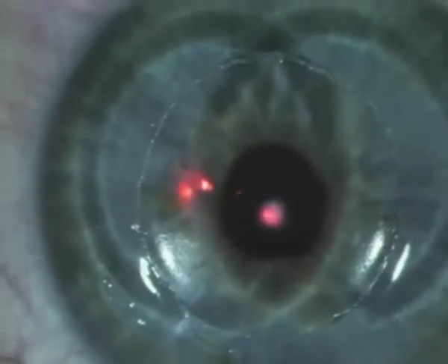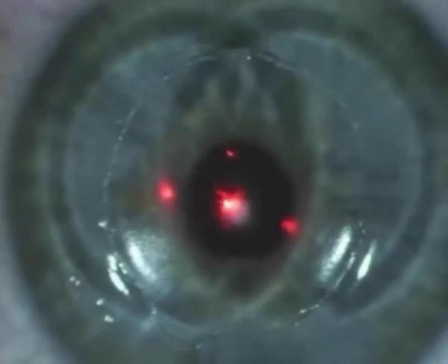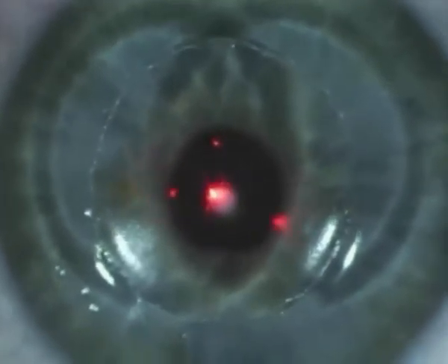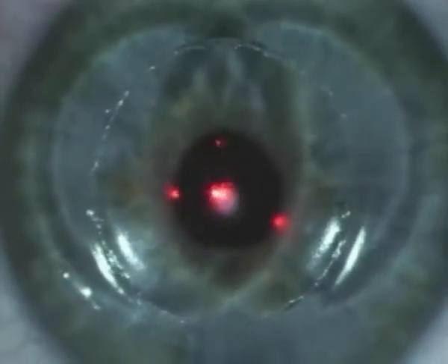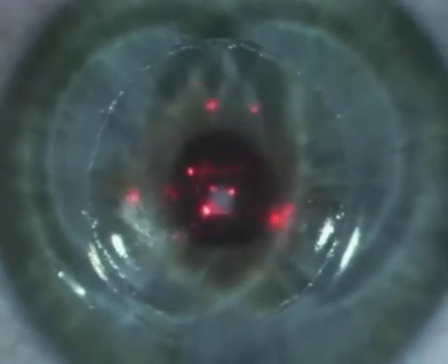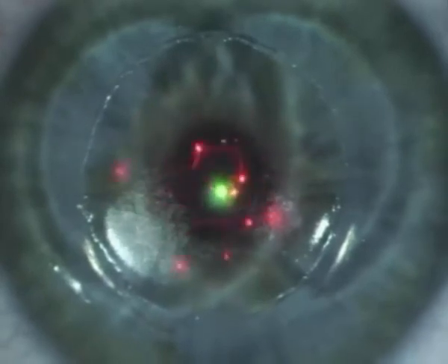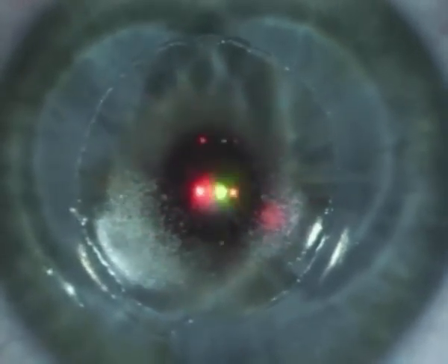We set up the cone for controlled atmosphere and perform the ablation. A little white, fluffy dot in the center of this patient's pupil is actually an anterior subcapsular cataract, which she's had congenitally all her life. The ablation is performed, and you can see it is contained entirely within the de-epithelialized zone.